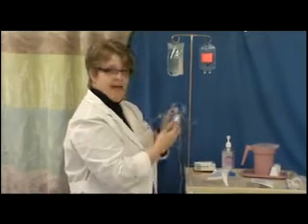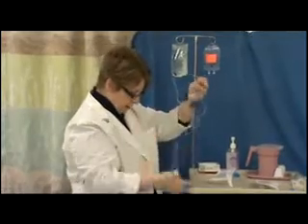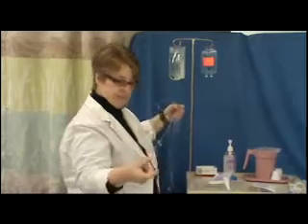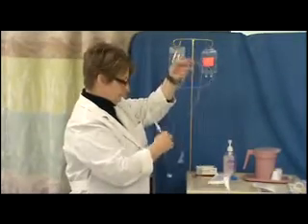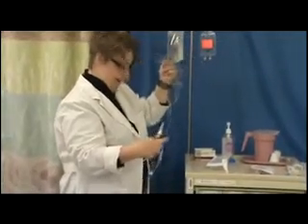If you spike your bag with your roller clamp open, the fluid will run all the way through. You'll have all kinds of bubbles. It will make a mess and it will waste your medication. So it's clamped. The roller clamp is on.